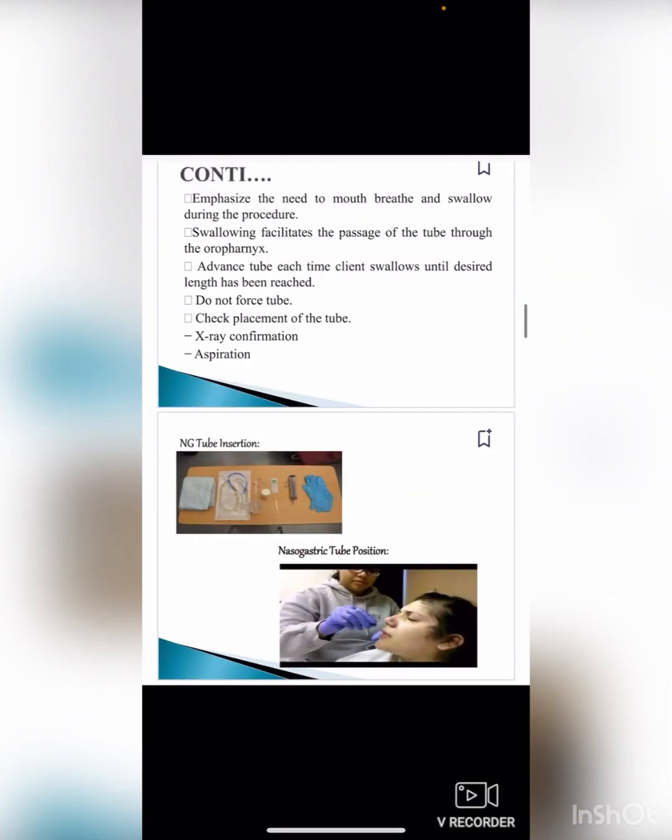Emphasize the need to mouth breathe and swallow during the procedure, as swallowing facilitates passage of the tube through the oropharynx. Advance the tube each time the client swallows until the desired length has been reached.